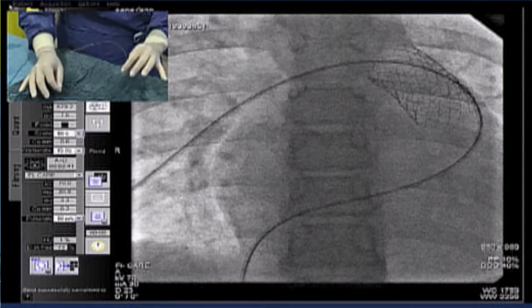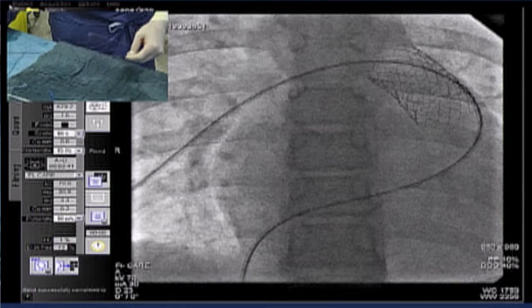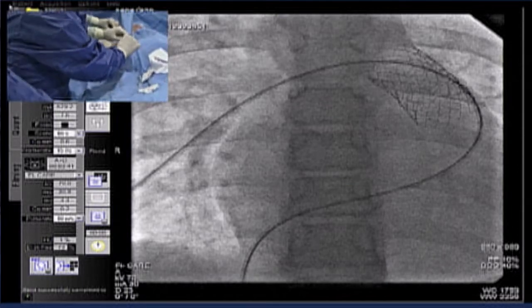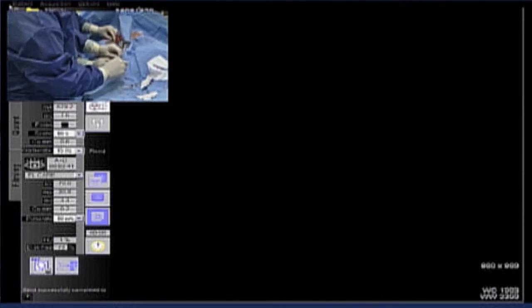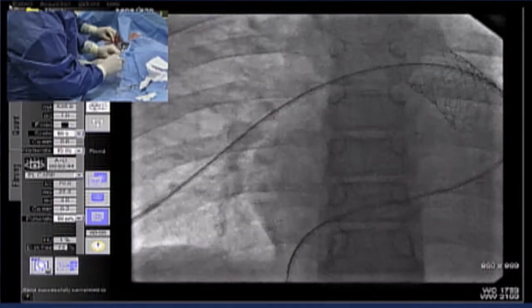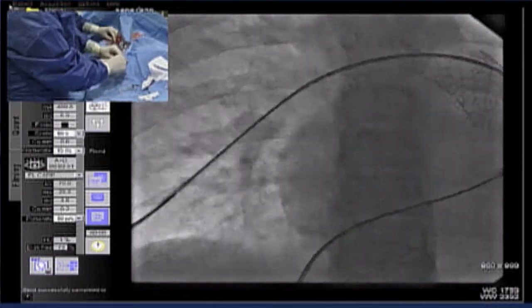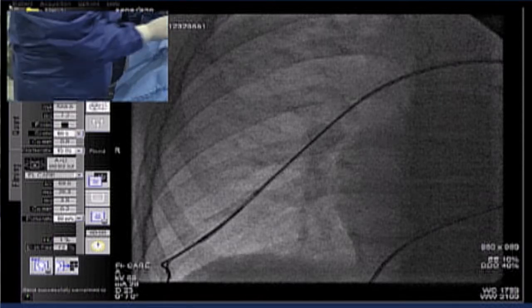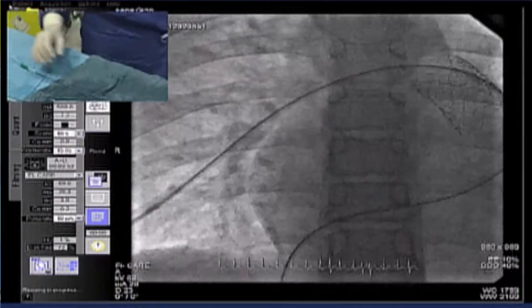It's almost impossible to get this pre-bend through a regular catheter in place, because you always will yank out the catheter from the pulmonary arteries. However, you now will see that going next to this wire into the rather stiff right coronary guiding sheath, it should be a piece of cake. FOS, show big screen. Yeah, so we're getting there. Agree that is easy. We remove the Thermo and we remove the right coronary guiding. And now we have a very stable position of a stiff wire through the outflow tract.